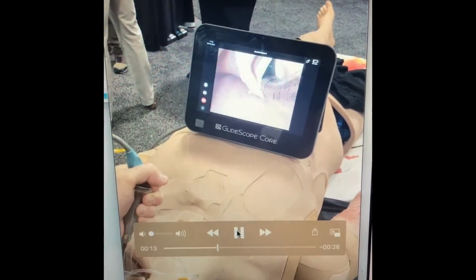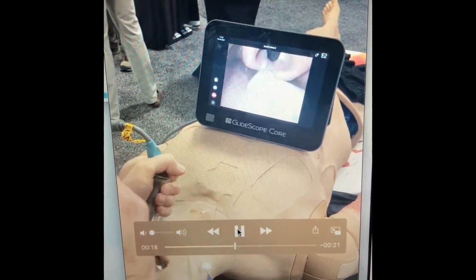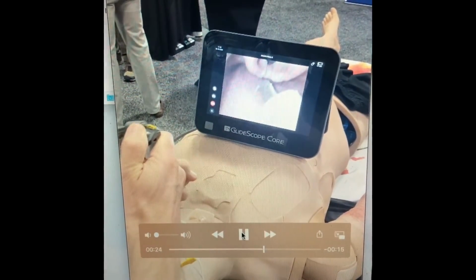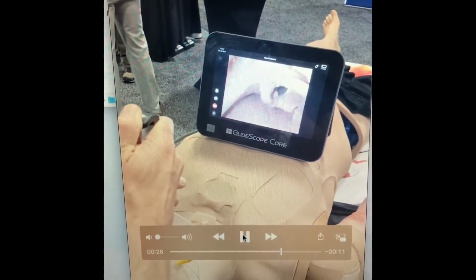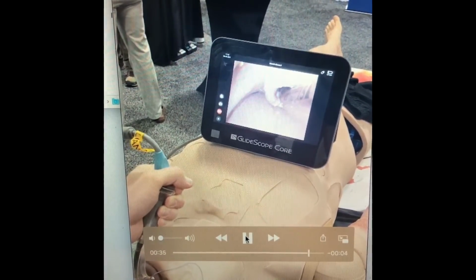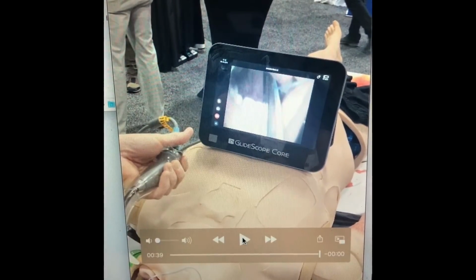And if this doesn't work and you are still stuck in the posterior and you're trying to move it around and trying to get up and over it, which is very common, and I've seen myself and other people just struggle back here, if you'll just gently, calmly come back a little bit with the scope blade, you can often put the tube right into place. So just take a deep breath, back out a little bit, and then go right into place. And hopefully those tips will help you.